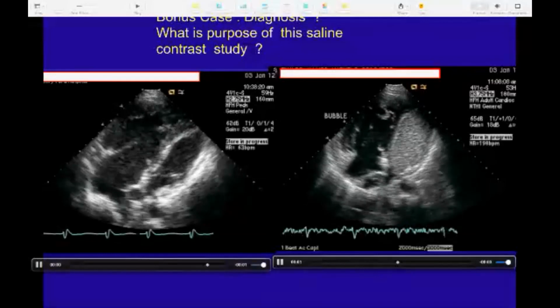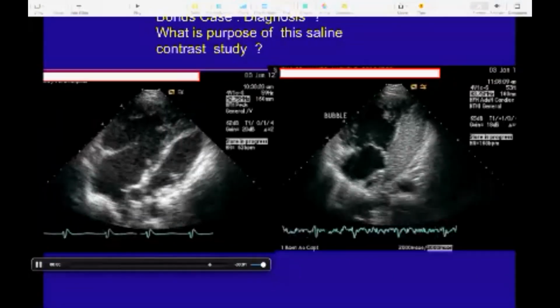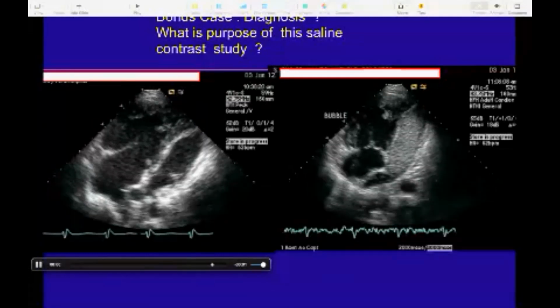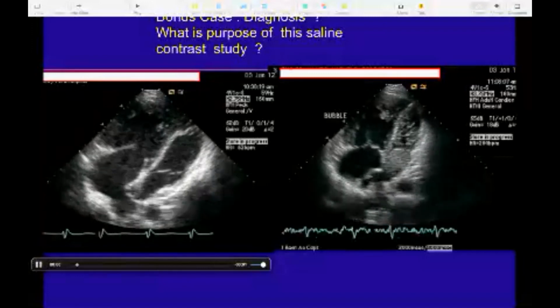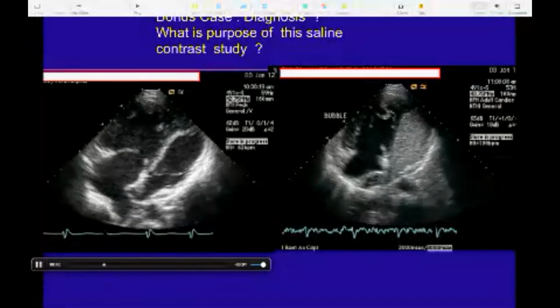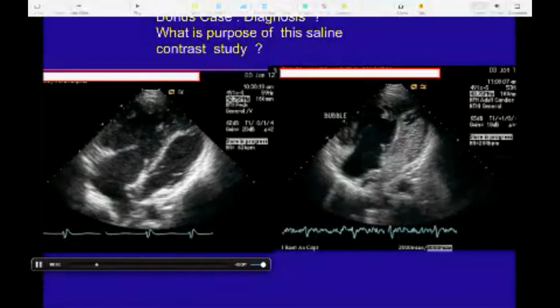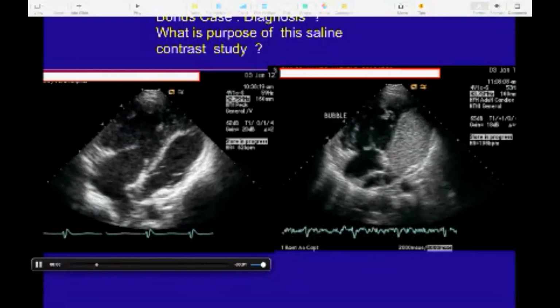And you can right away see the first thing to note, obviously, when we deal with congenital heart disease is what is where, because things can be all over the place in congenital disease. First is to define the atrioventricular concordance. So in an adult patient, at least I would start that way. You can see that here you have the atria opening via a valve into another chamber.